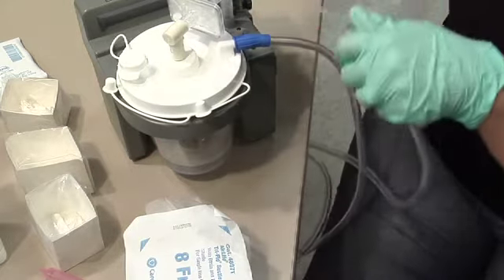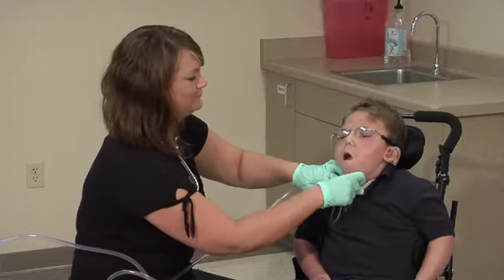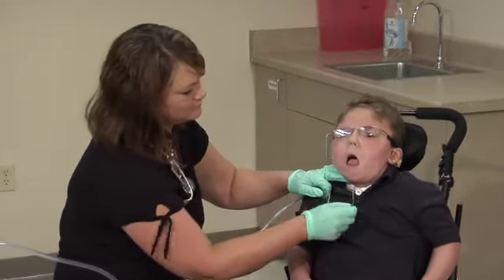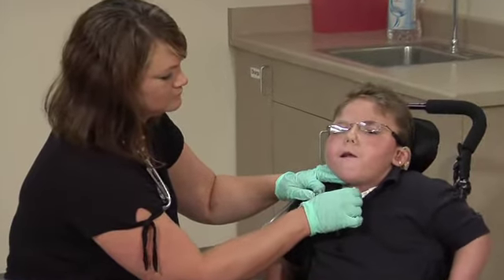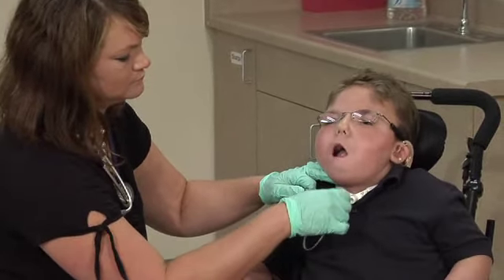Lubricate the catheter with normal saline. Remove the artificial nose and insert the catheter while gently rotating within the cannula, with or without applying suction. This is based on how the procedure is completed in the home setting and the healthcare provider's order. Advance the catheter into the tracheostomy tube to the measured length.